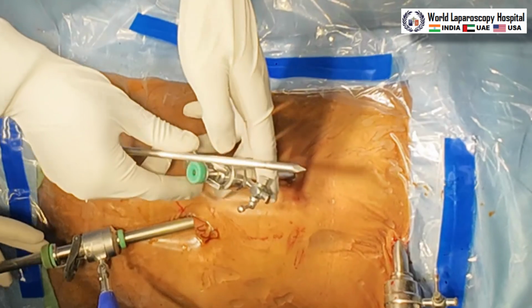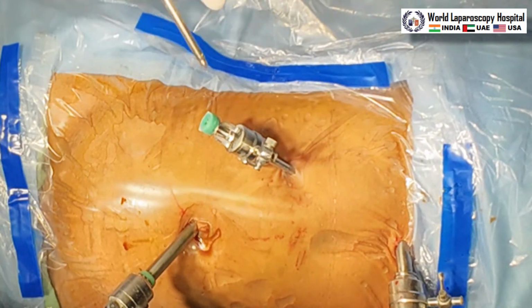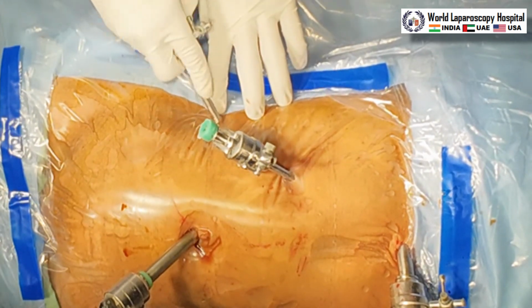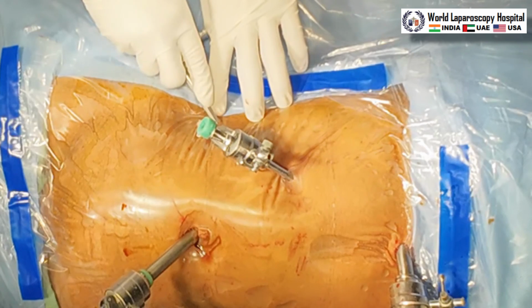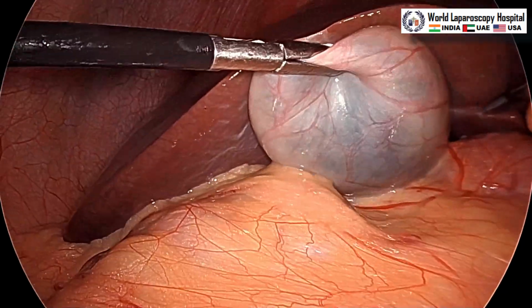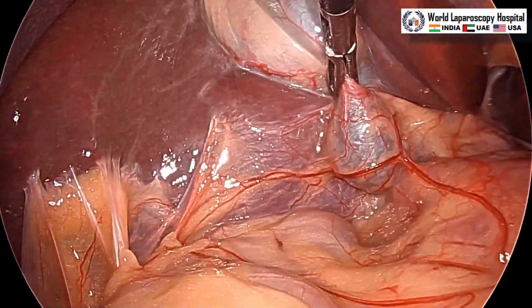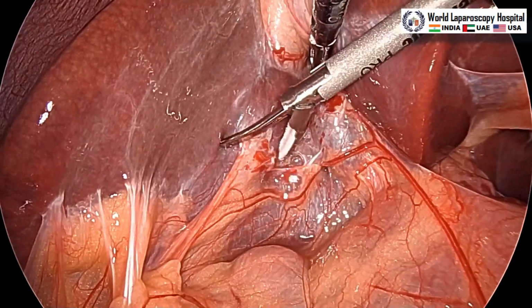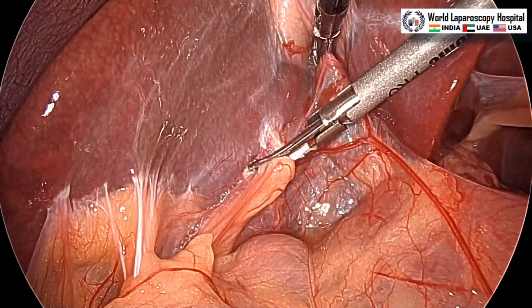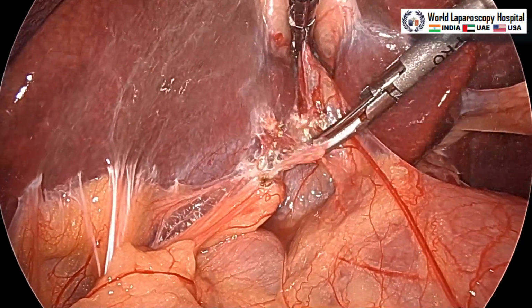Now, the fourth port is 7.5 centimeter lateral and 7.5 centimeter below, almost at the level of the umbilicus in the anterior axillary line. This port will be used for the fundus grasper and now the fundus is lifted and pushed towards the right shoulder. Now, the first step is adhesiolysis. These are just flimsy adhesions which will be separated. We are using the harmonic scalpel to just separate and strip them down.